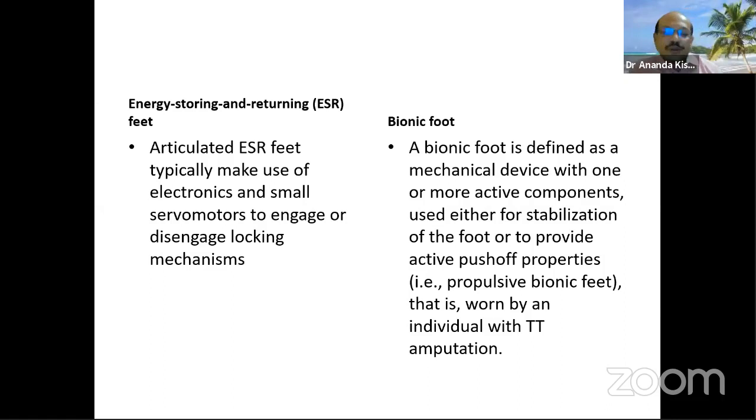Yeah, I understand your point. So first of all, what are orthosis and prosthesis? They are different. Orthosis is where the limb is completely present, but its functions are lost; we are enhancing the function of a limb which already exists. So if the limb is existing, that is basically an orthosis. But if the limb is completely amputated, and something is required to replace it, that is the prosthesis. It's very easy. I already showed the transtibial orthosis, the transtibial prosthesis, and also the PTB orthosis.